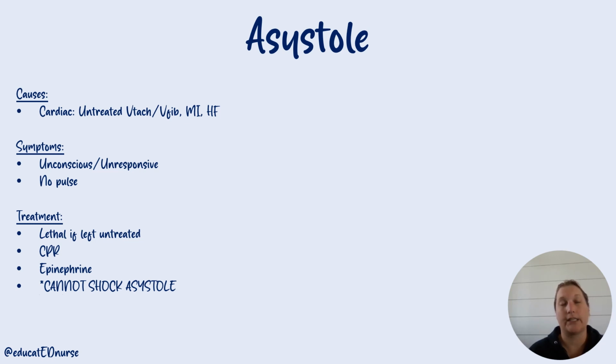With this patient, the only thing that you can do is CPR and epinephrine. You cannot shock this. So regardless of what you see on TV or on Baywatch or whatever, that flat line, if your patient has a flat line, you can't shock that. A defibrillator will not work. It'll say no shock advised, continue CPR. So CPR and epinephrine is the only drug that you can try here, and then try and fix acidosis.